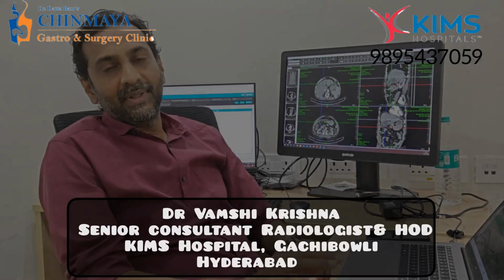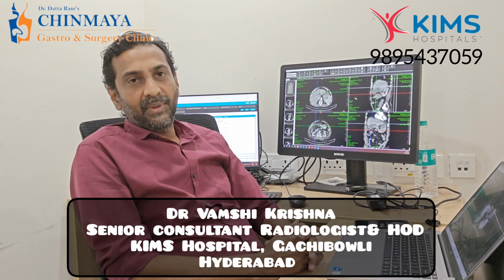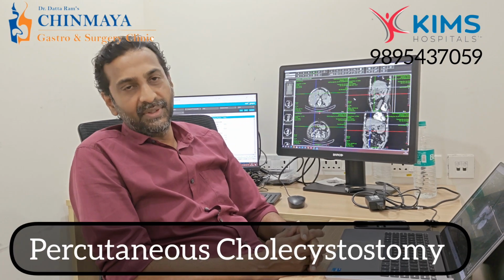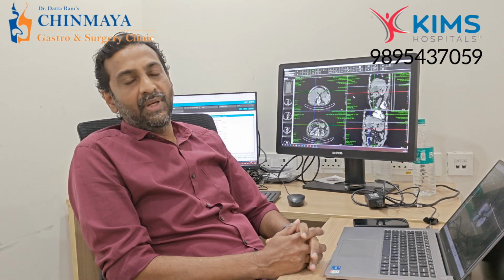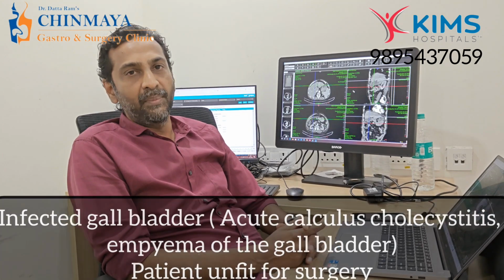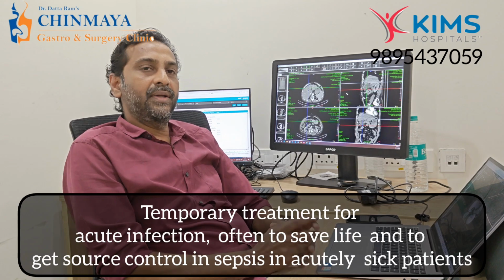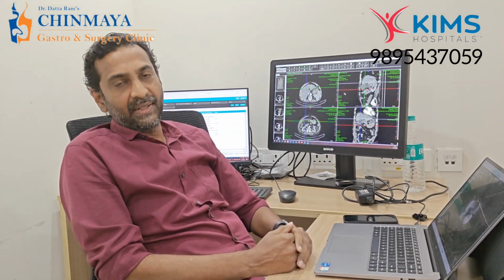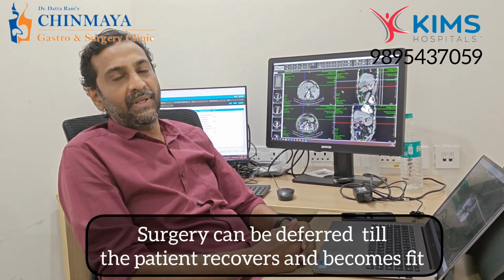Hi, I am Dr. Vamsi Krishna, Consultant Radiologist at KIMS Hospital, Gachibowli. Today I would like to tell about a procedure, percutaneous cholecystostomy, which is a simple and life-saving procedure, that can be done in gallbladder stones, where the gallbladder is infected and the patient is not fit for surgery for the time being. Usually it's a temporary procedure where we put a catheter or a tube into the gallbladder and get the pus out of the gallbladder till the infection subsides, and later on an elective date you can take the patient up for surgery.